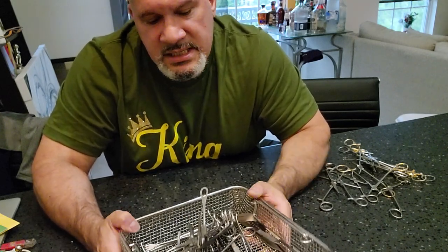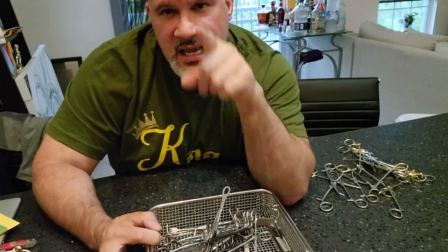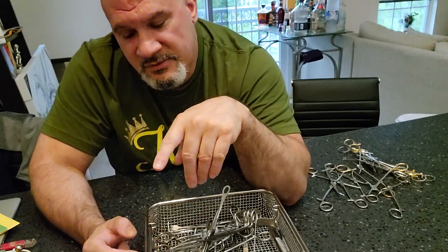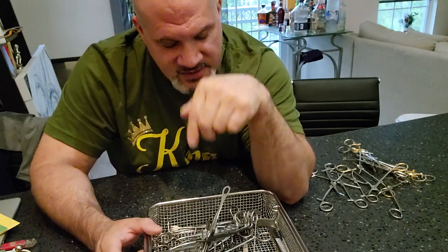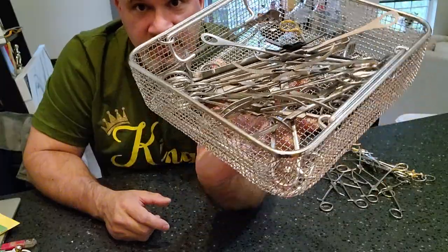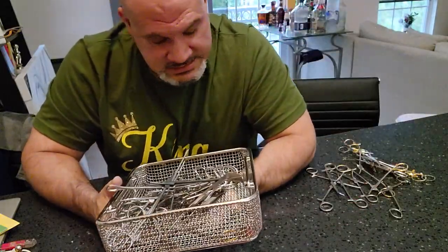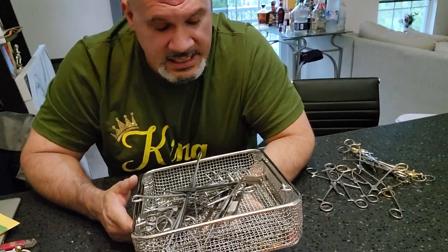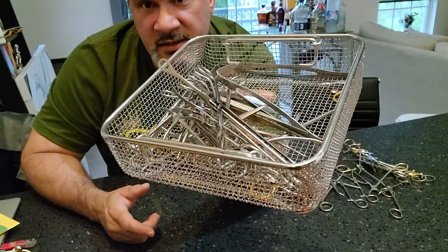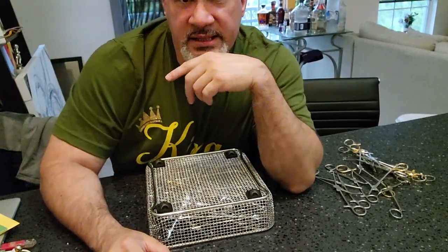We're humans, and human error is always going to be there. Even though it went through the washer cycle with a disinfection cycle, OSHA 1910.1030 states you should not be reaching into a basket where sharps aren't really visible. Look at this basket — can you identify where the sharp ends are at very quickly? I'm looking right at it and I can't even see that sharp Weitlaner, and I know it's in there. Dumping is not a bad thing, guys. Slamming is a bad thing. Peace.